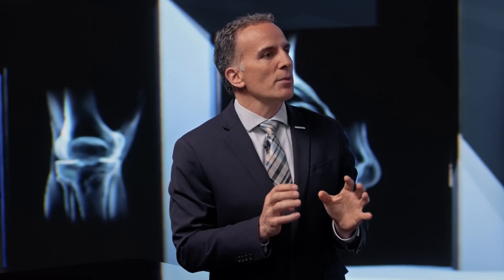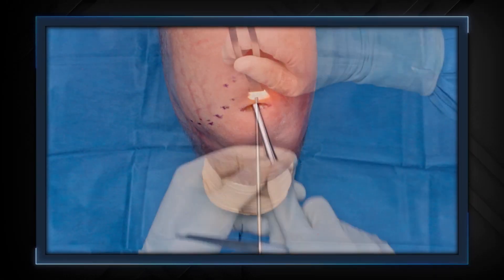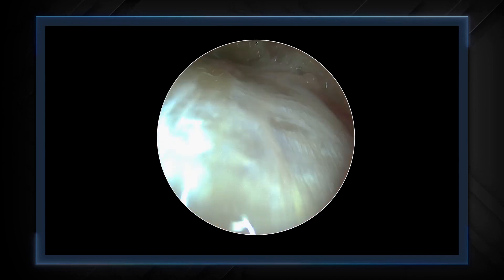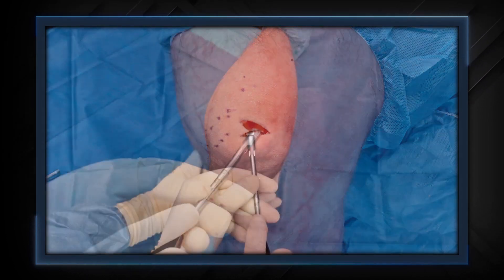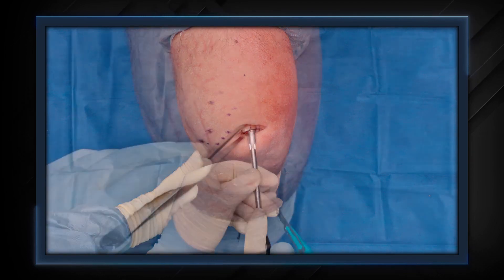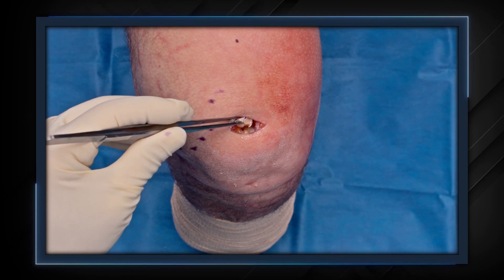Gentlemen, we know with any innovation, there's always a learning curve. John, what is your best pearl for someone who is starting to use the quad tendon for ACL reconstruction? I think there are several, but the first is visualization. You need to see the quad tendon. Resect the fat, use a retractor, get the scope in there and look at it. Know which direction you're going. Then you have to make sure you have full thickness cuts of the distal three centimeters of the tendon. I use a double blade knife, get three centimeters, free it up.